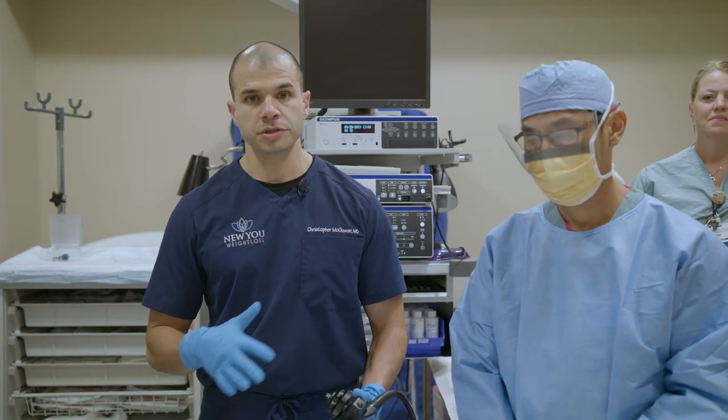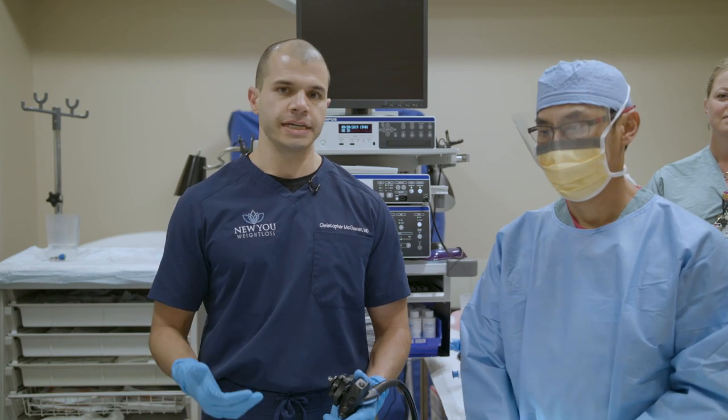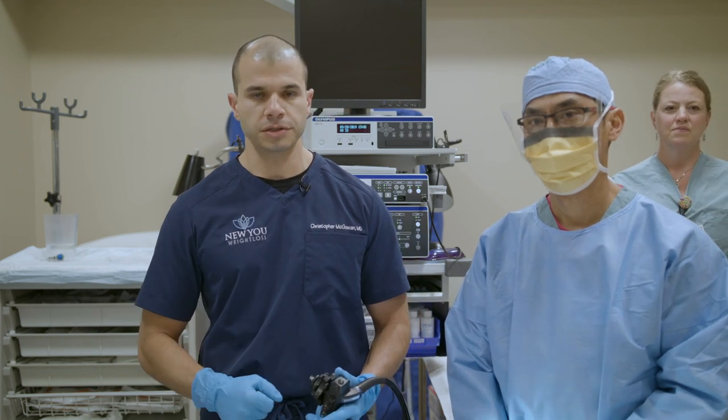Good afternoon and welcome. We're here in North Carolina and we are ready to do a live endoscopic sleeve gastroplasty or ESG procedure. We are going to show the whole procedure from start to finish. Thanks so much for joining us. I'll basically talk through the whole procedure and explain the technique. We're also going to answer questions, so please write in with any comments and we'll answer any questions that you have.